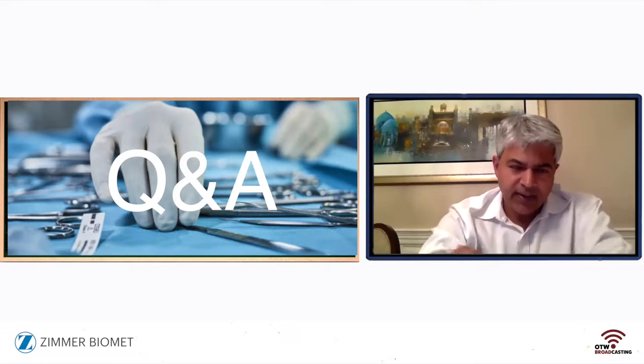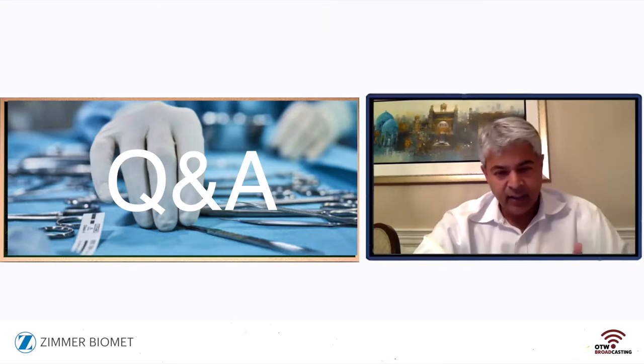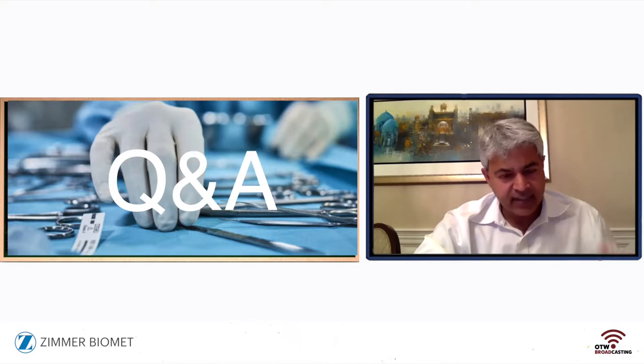Yeah, so I'd say that the biggest benefit is going to be motion preservation. If you can imagine, if you have a curvature in your back and you put rods in, you're going to make that spine look very straight. And certainly on an X-ray, it's going to look very acceptable. But we recognize that with those rods, you're going to have some degree of loss of motion, whether it's a lot, i.e. you're extending into the lumbar spine, or at least it's some when you're in the thoracic spine.